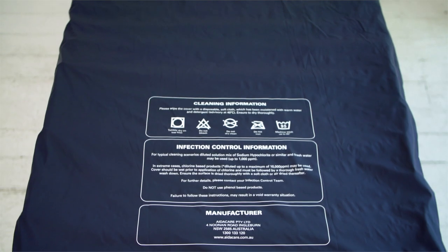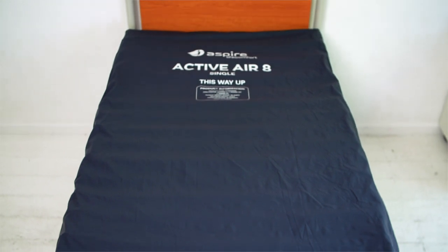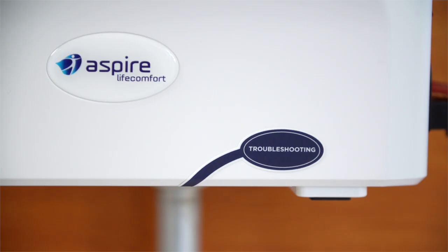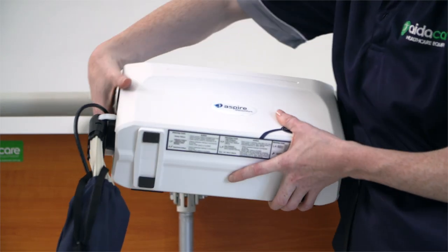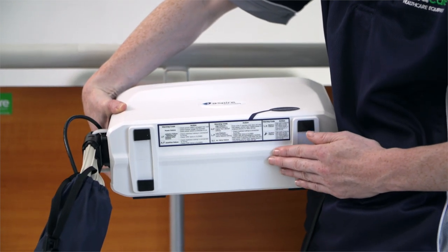Urgently addressing errors detected in your alternating air mattress is vital to protect the user. If an error occurs, the LED screen will illuminate with an error code. Follow the troubleshooting guide on the pump and match the error code to the problem. You may be able to easily solve this; if not, contact your Aspire dealer.